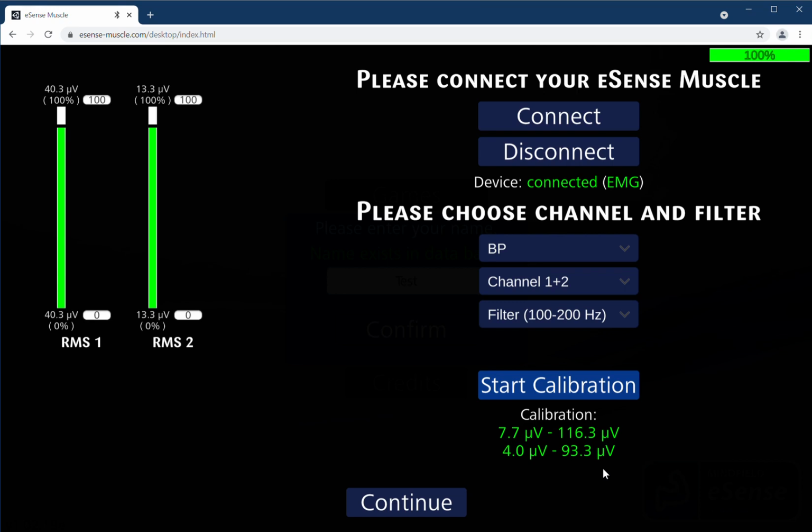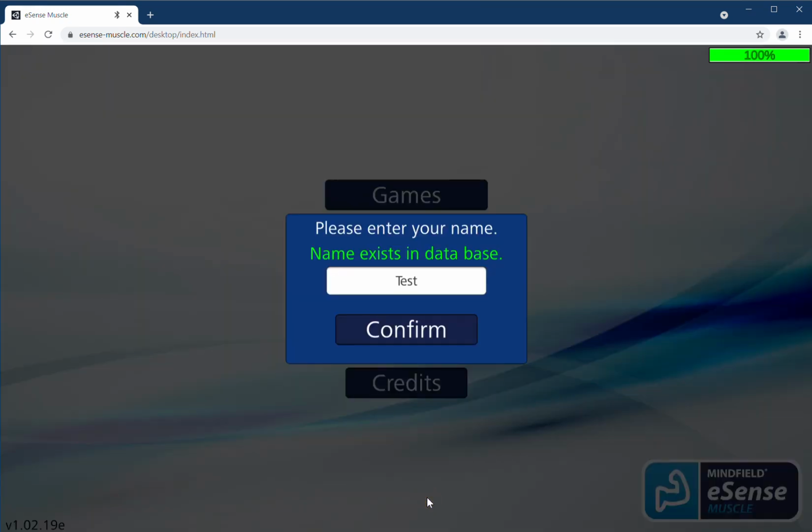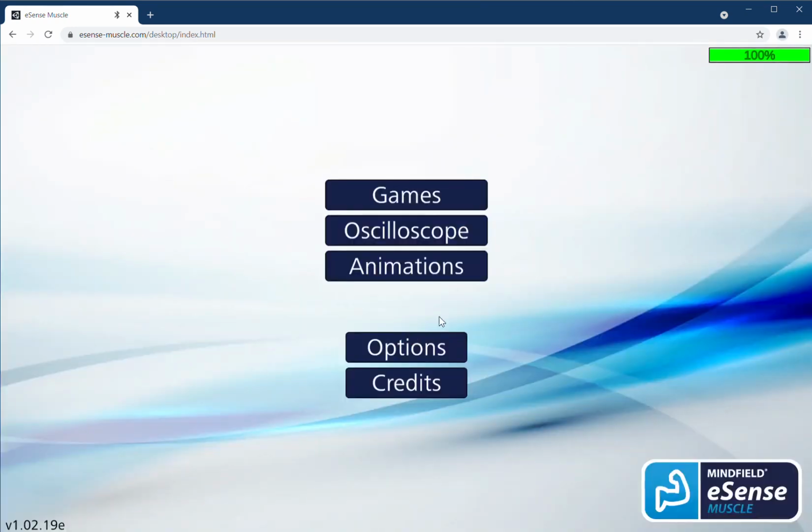So I did not exactly contract my muscles in the same way. But that doesn't matter. I can always recalibrate later on if I want to change that. And of course, also the electrodes are not perfectly fitting in this exact same position in a symmetry from left and right arm. So now I'm asked to enter my name. I'm using here the test account. Okay. And this is the main menu you will see now here of the eSense web app.